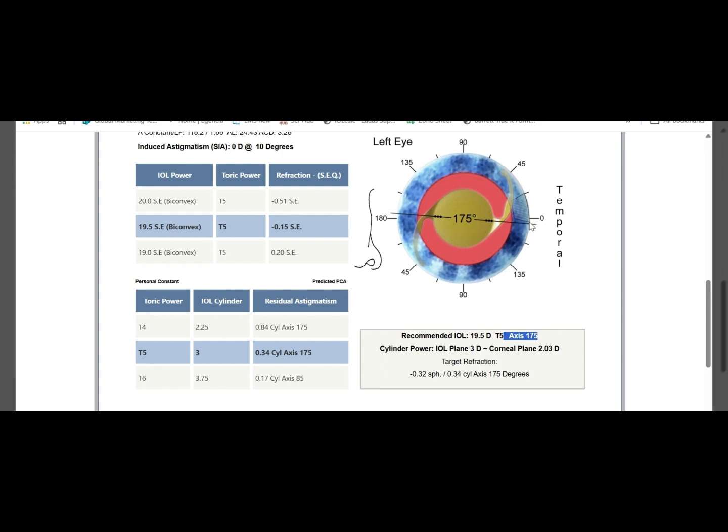Now, if you are a doctor, you should first do a gross alignment. So you inject the lens and stop short over here, say 20 degrees away from 175 degrees, somewhere around this plane you stop, and then you remove the viscoelastic, especially from behind the lens, and then go into the final alignment.